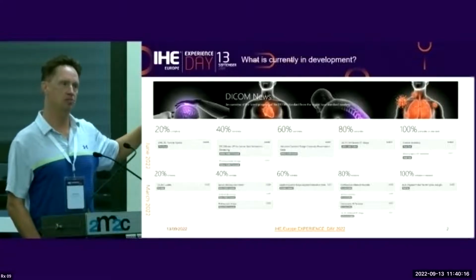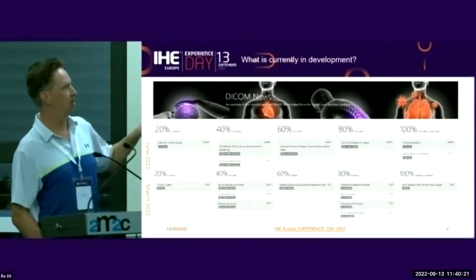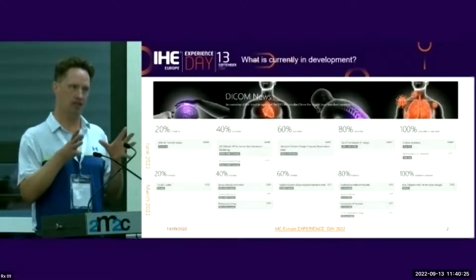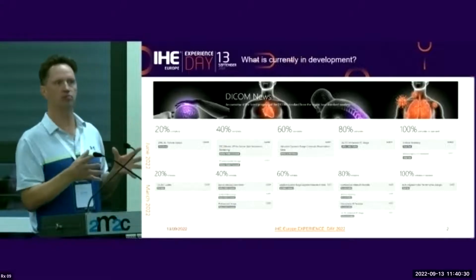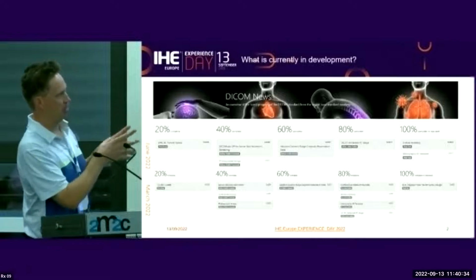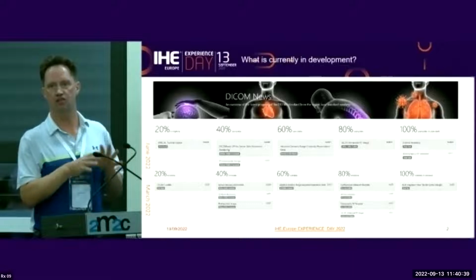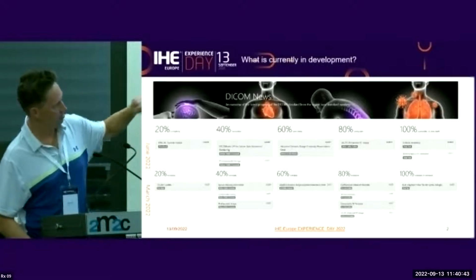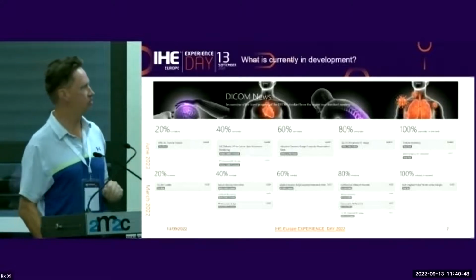So this is the meeting series where all these DICOM groups get together with the base standard group. That's where I work. And we try to make sure that anything that gets into DICOM conforms to the overall picture of the standard. So that's sort of the centralized loophole to get through to make it into the standard and that everything looks alike.